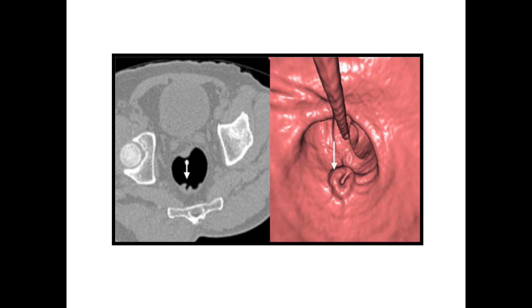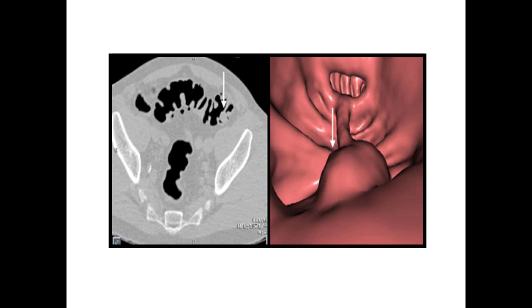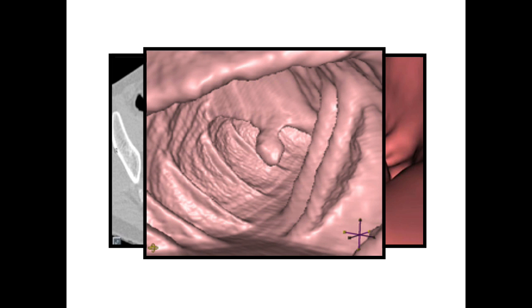Here's an example: a lesion posteriorly in the rectum — this is the fly-through snapshot view. You can see the rolled edge and puckered surroundings; even on that view it looks a lot like a cancer. Here's another view on the 2D — this is a diverticular stricture or segment of the sigmoid colon. It's difficult to see, but you can still make out the stalk and a polyp. On the fly-through view you can see quite nicely, and in the same patient, a polyp on the fold is visible on the snapshot view.